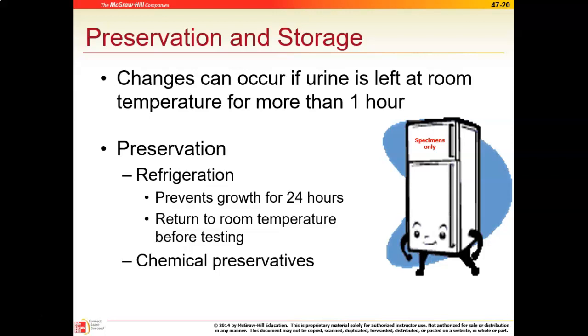Okay, so preservation and storage. Things can happen to the urine if it's left out for too long. And so prototypically, if you're going to do urinalysis studies, it's good to make sure that you do it within the first hour. If it's going to be longer than that because the day is busy and there's lots of patients leaving urine specimens, then you can stick the urine in the refrigerator. Okay. The refrigeration can prevent growth of bacteria for 24 hours, but if you start getting longer than that, bacteria can start to grow that maybe aren't pathogenic.